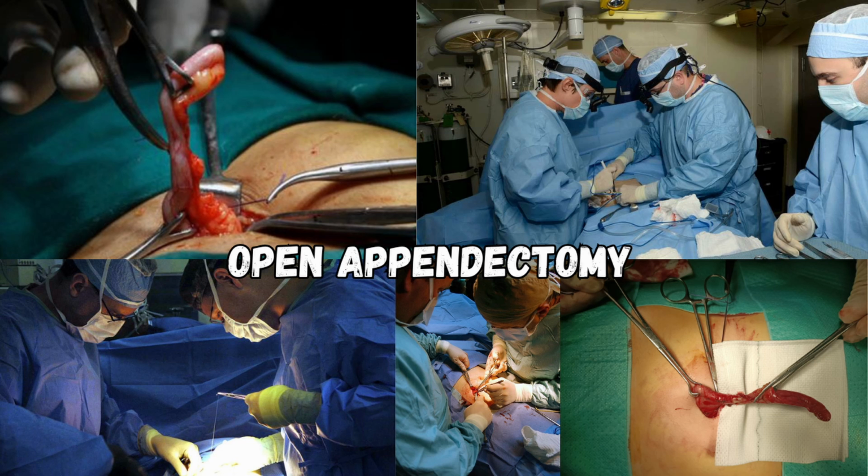Final step. Dressing and recovery. A sterile dressing is applied. The patient is awakened from anesthesia and extubated. Postoperative monitoring includes signs of infection, pain control, and early ambulation.